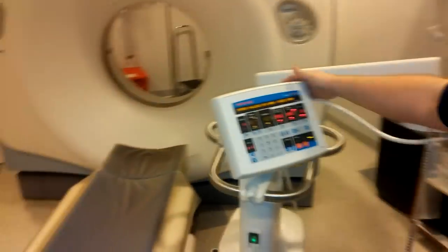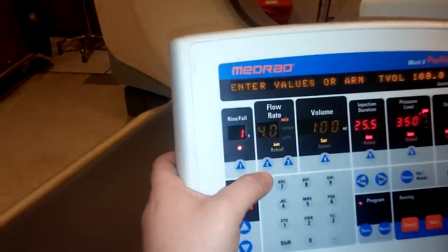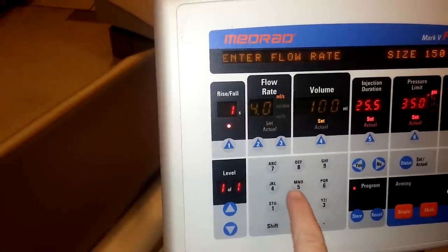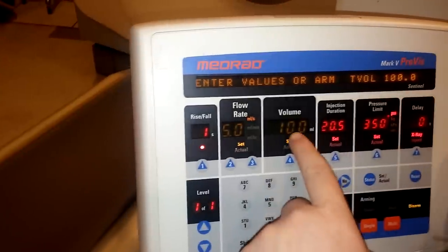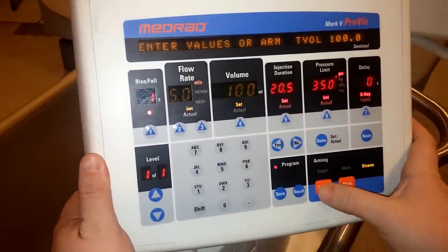We're going to come over here and set it up. We'll begin by changing our flow rate, so we're going to hit number two and type in — this is a PE study — so we're going to do 5.0, set 100 milliliters, then we're going to arm it by hitting single.